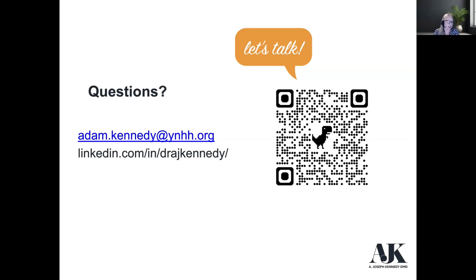Thank you. And then this next question came in a little while back, before the latter slides you showed, so they probably got their answer, but how long do you think 3D printed teeth last? Hard to say. Again, all the studies right now are in vitro benchtop studies. And so it's showing promise that these things will last pretty long. There have been some studies specifically with resin dentures versus the PMMA. And we know that resin typically doesn't hold on as long as the milled PMMA. It just wears out faster.